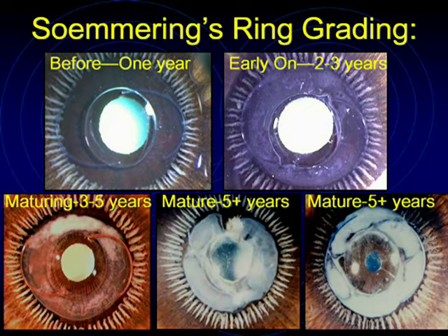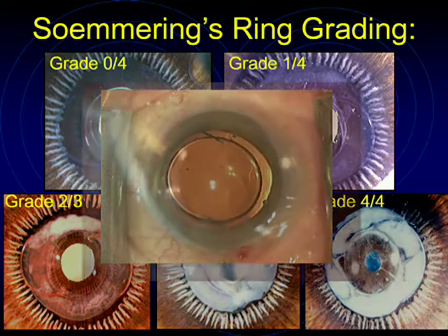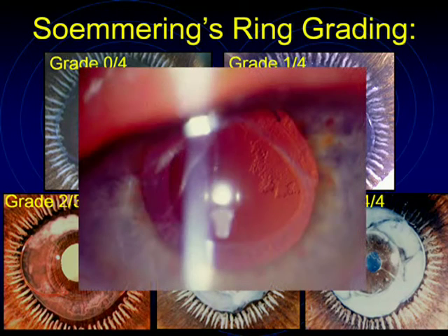Probably a better way for clinicians to consider the formation of Soemmering's ring in viewing Miyake-Apple specimens is to consider it like tree rings, an indication of survival following cataract surgery. The implication is primarily with regard to posterior capsular opacification. The question is, how do you take this, the implant in the bag, to here, with a well-formed capsular bend and clear posterior capsule, and try to avoid this, posterior capsular opacification due to regenerating cortex over time?